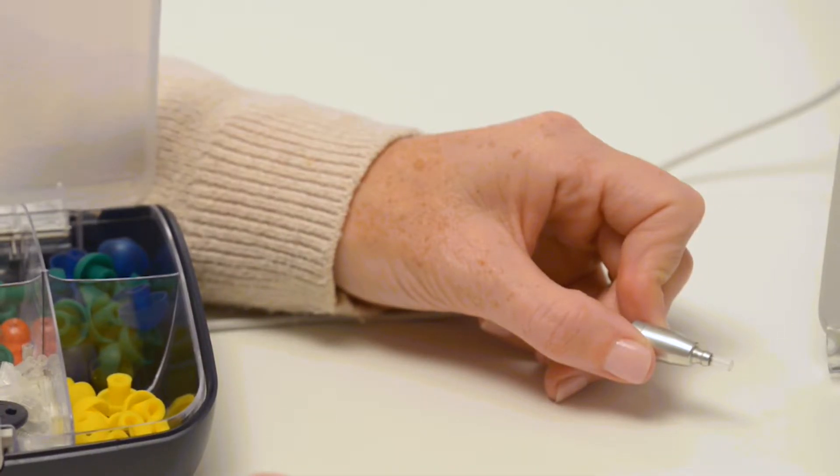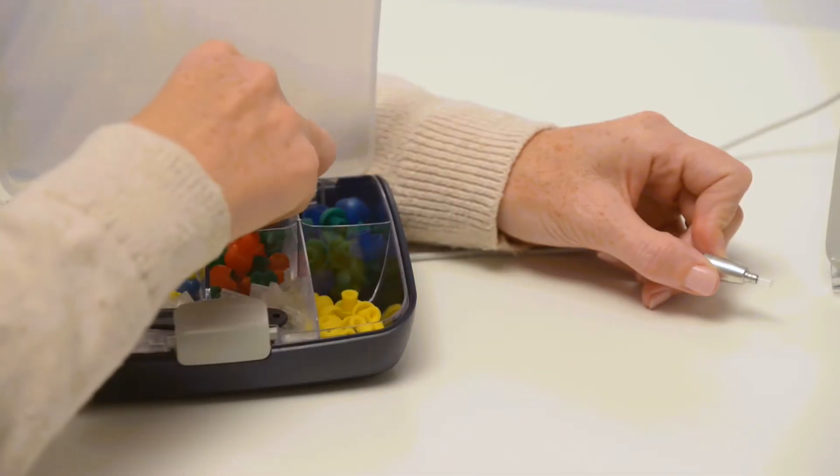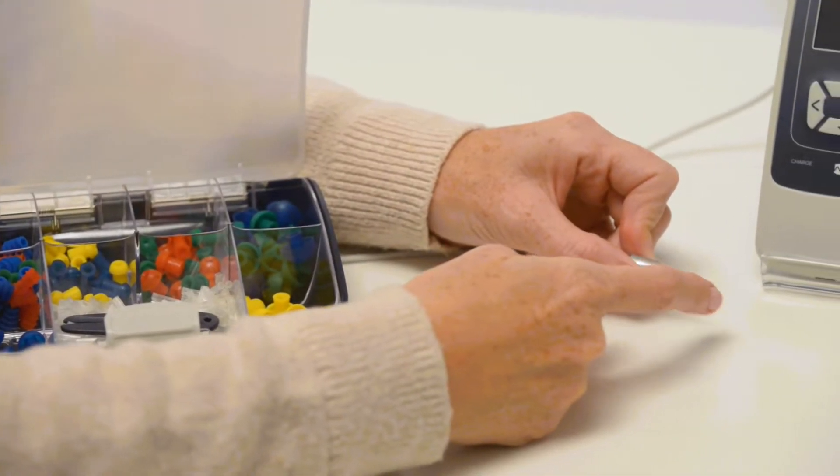Inspect the probe tip between patients to ensure it is clean and free of debris. If there is an obstruction, replace the probe tube. An occluded probe will impact test results.